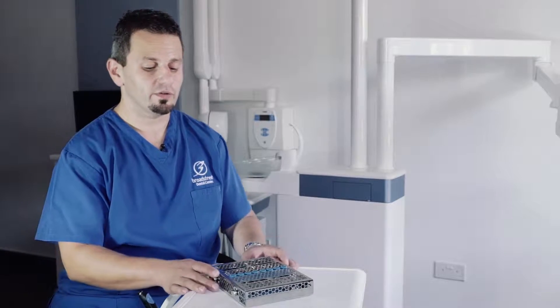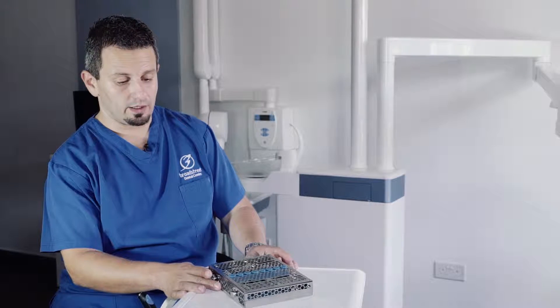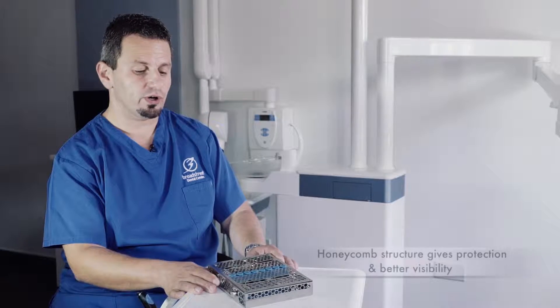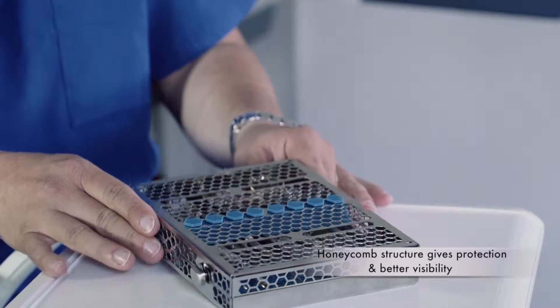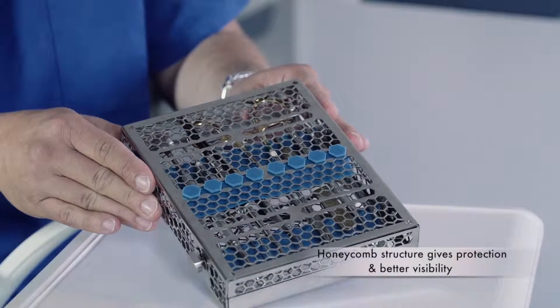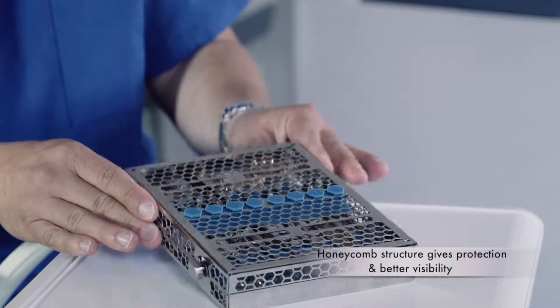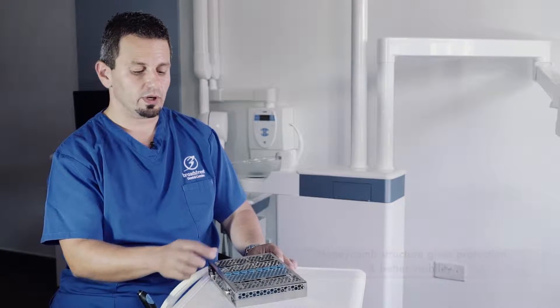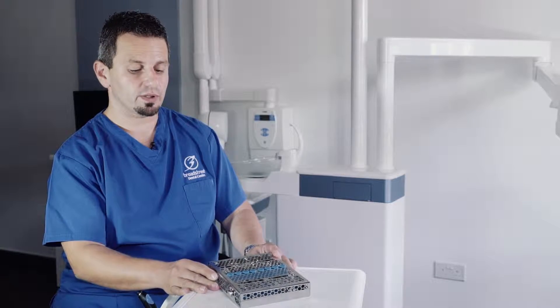This is actually my favorite cassette because it is the most versatile. First of all, I like the fact that it is very open and you can see through it because of the honeycomb pattern. It's obviously very good for the sterilization process, and at the same time, the cassette in itself is very sturdy.